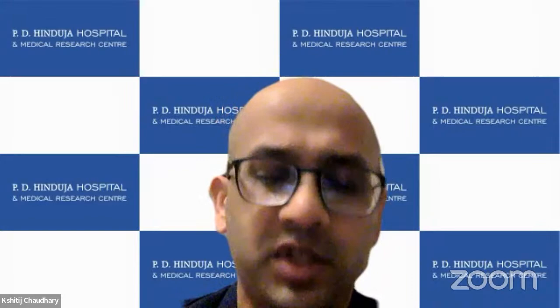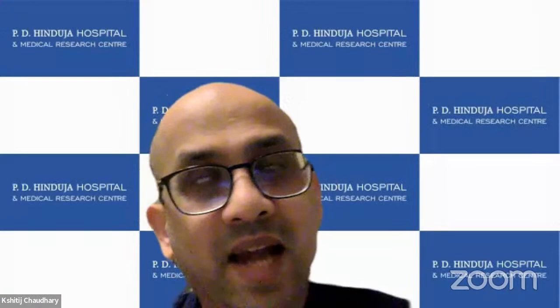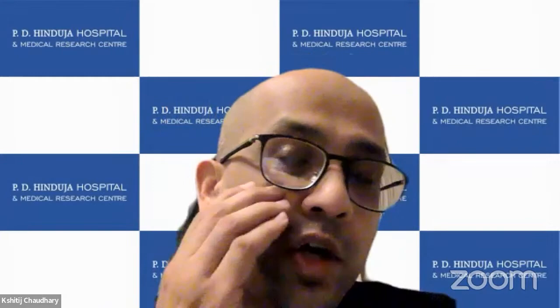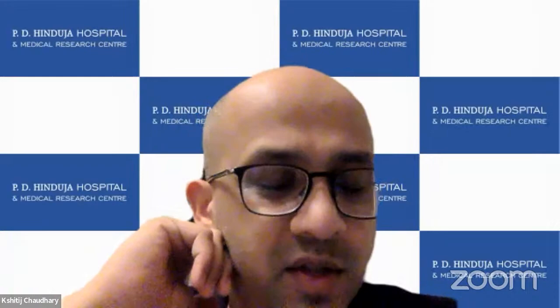Obviously, because the injury is occipito-cervical, the surgery is going to be occipito-cervical fusion. How much of the cervical region do you want to fuse from the occiput? That depends on the kind of fixation I get. If I am going to get a transarticular screw, going from C2 into C1 and then connecting it to the occiput, I'll stop there. If not, then I might go with a C2 pedicle screw and maybe another one at C3.